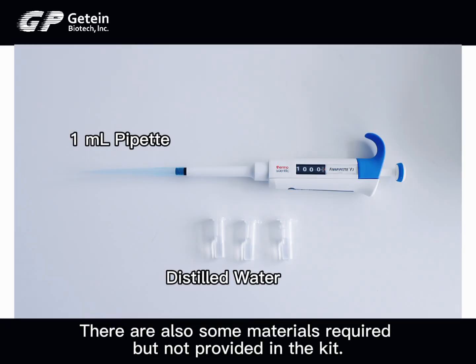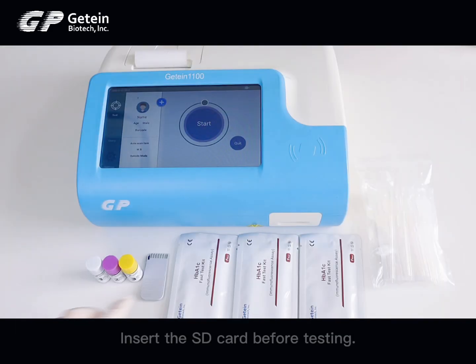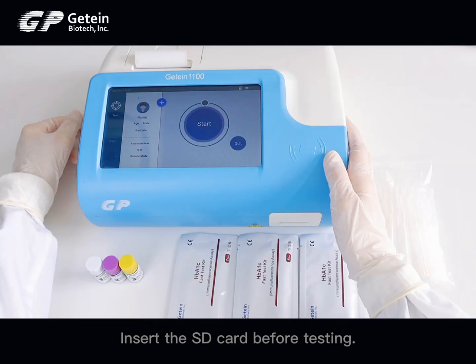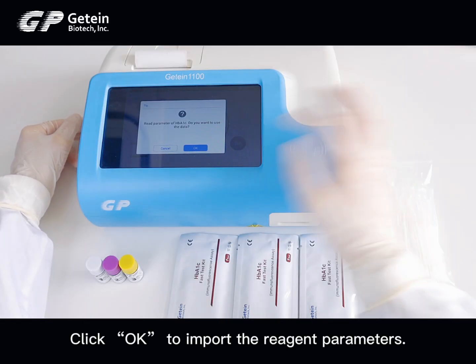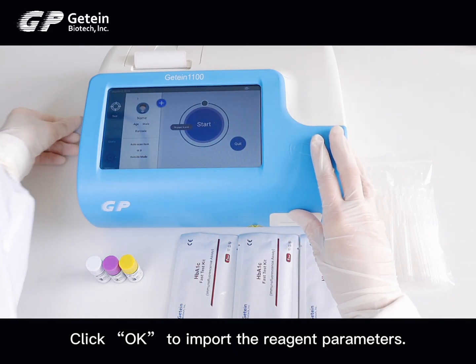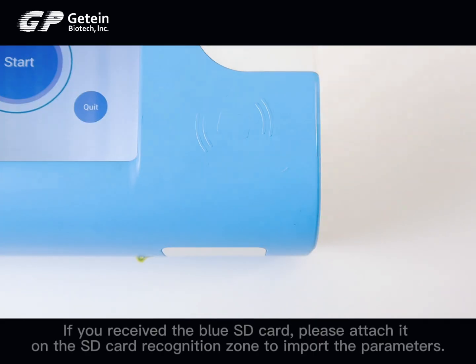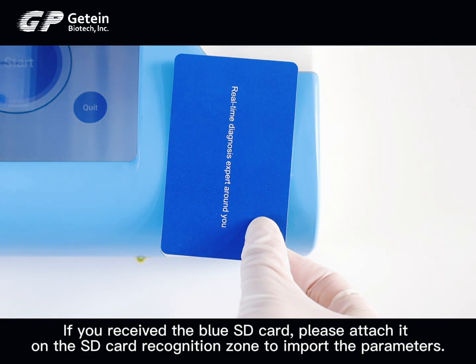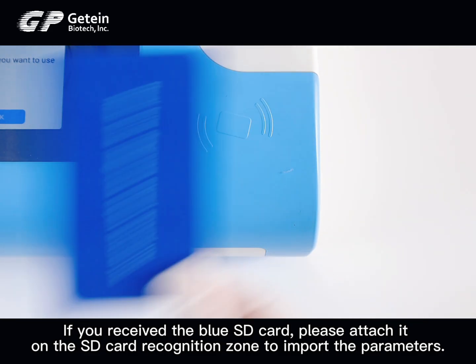There are also some materials required but not provided in the kit. Insert the SD card before testing and click OK to import the reagent parameters. If you received the blue SD card, please attach it on the SD card recognition zone to import the parameters.